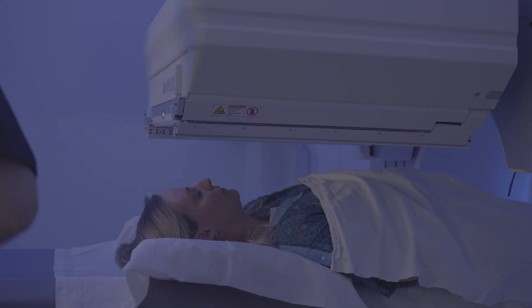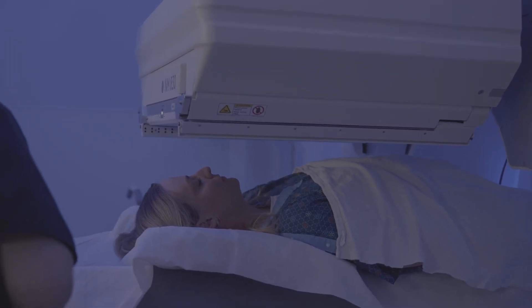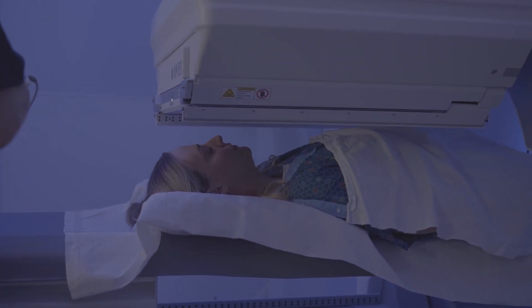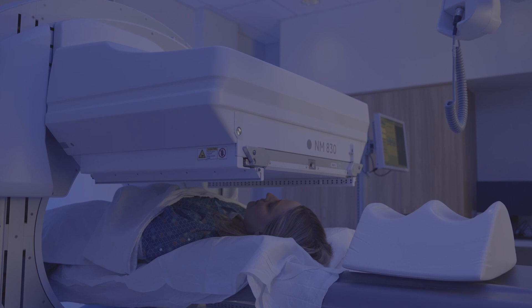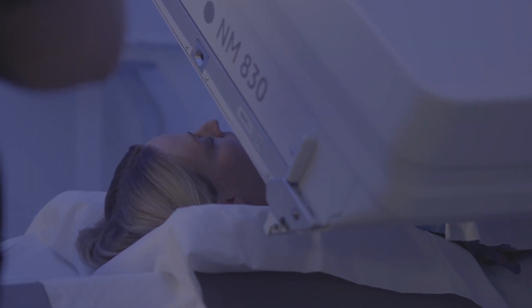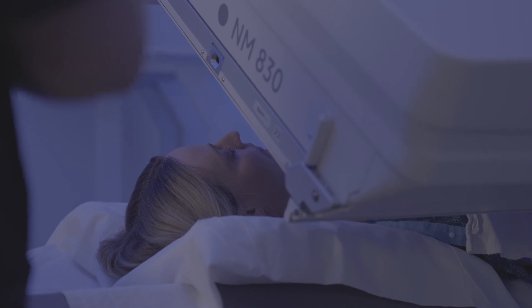The reason we use this scan is to help, in one sense, try to localize abnormal parathyroid glands. In another sense, in this practice, we use the results of this scan to help functionally test the parathyroid glands when they're identified. So it's an important test for those reasons.